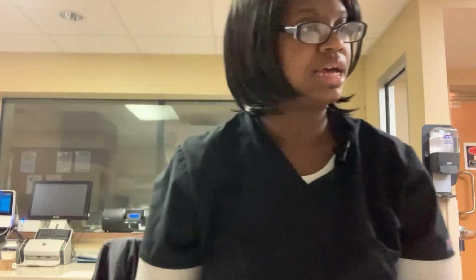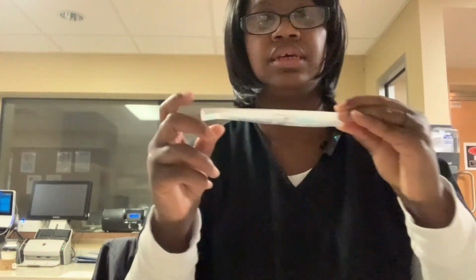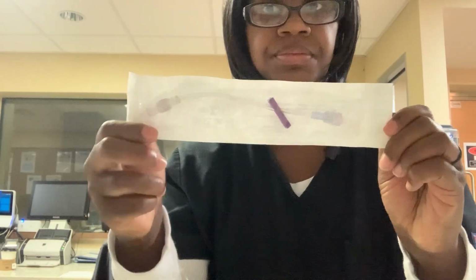Okay, I have to give MRI contrast today. So I'm going to show you all my supplies. So I have some saline, the MRI contrast, alcohol prep pad, and then whichever needle I'm going to use. And then my extension tubing.